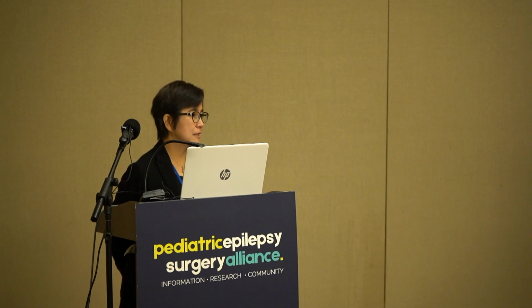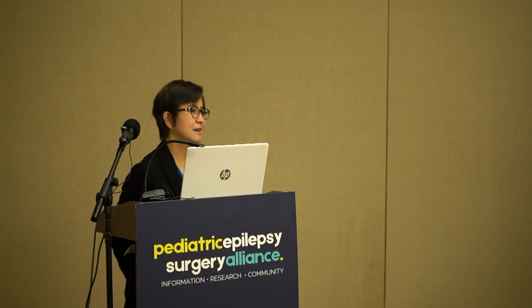If one of those tests is normal or negative, then potentially consider additional tests. So let's say if magnetoencephalography doesn't show an abnormality, then consider including PET scan. If one test is not helpful, then do consider additional tests.